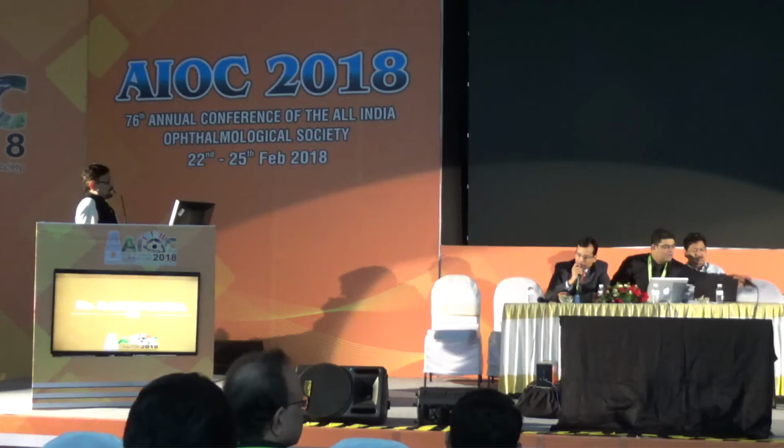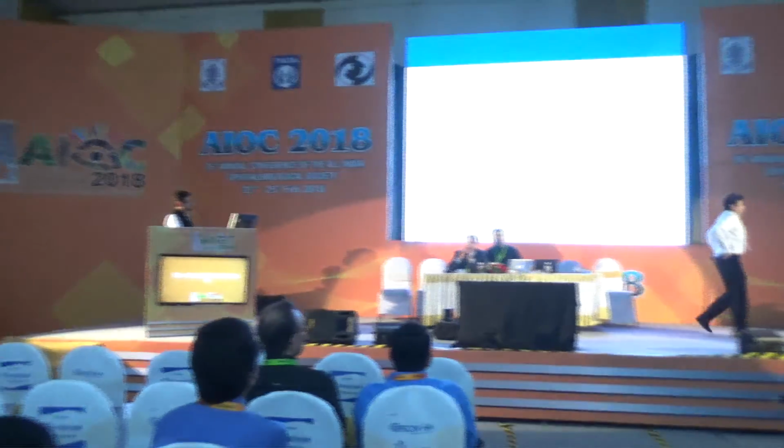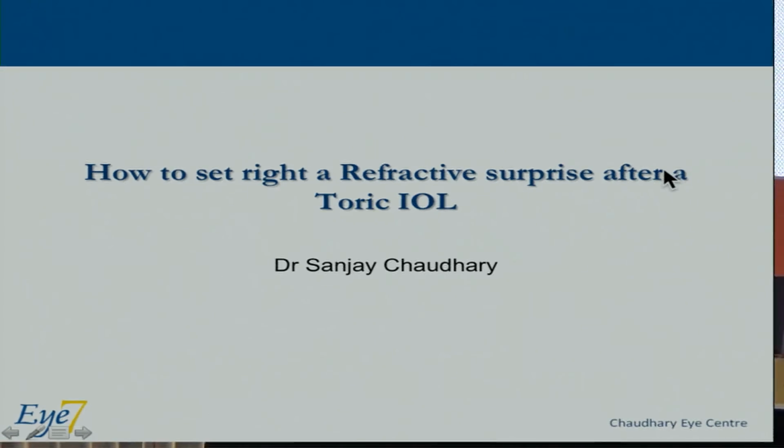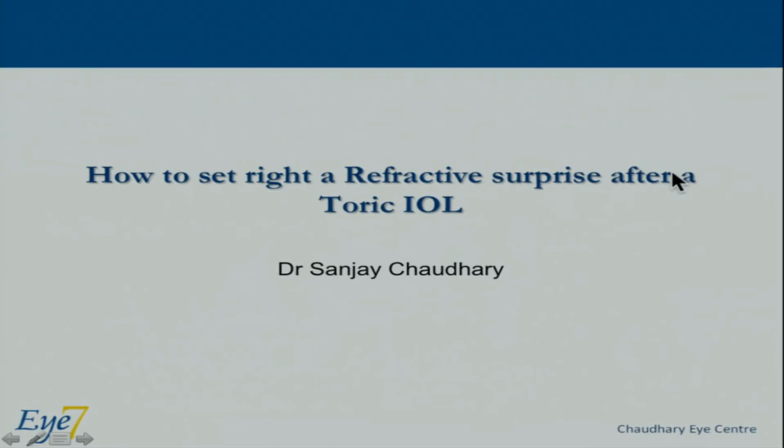And Dr. Rajesh, thank you for the excellent presentation on the case selection and preoperative workup on toric lens. You mentioned a very important point about the hydrophobic lens, which causes a shrink-wrap effect, which is very important to provide the long-term refractive stability of toric lenses.